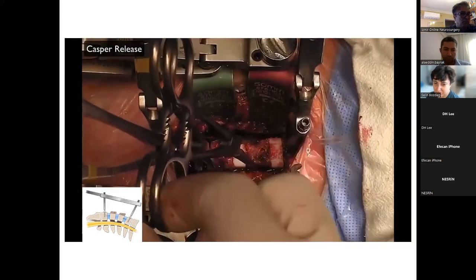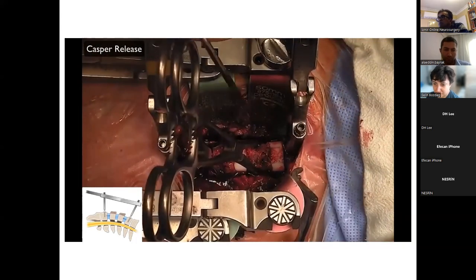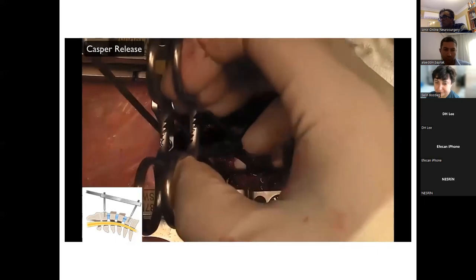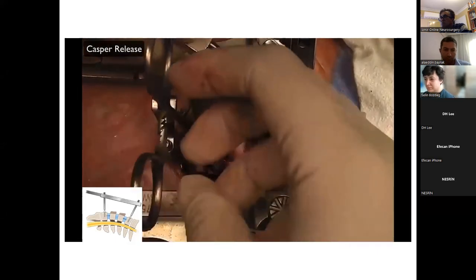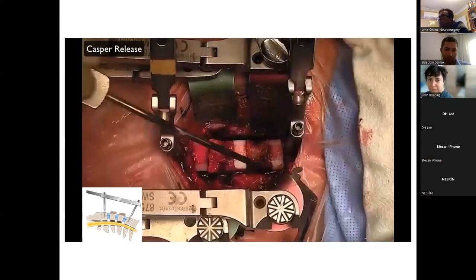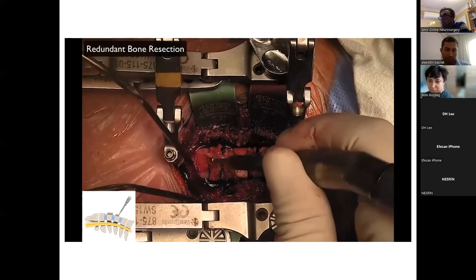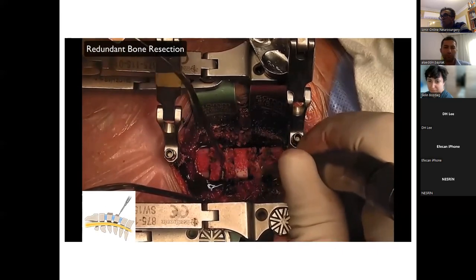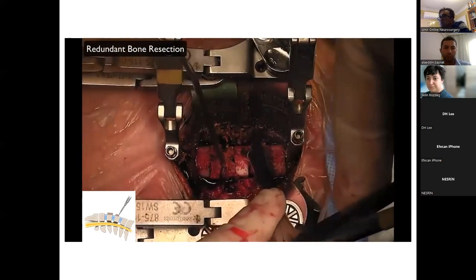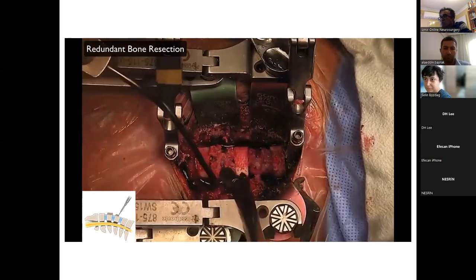First, the allograft is usually inserted at the middle level, followed by the uppermost and lowermost levels. After inserting the bone graft, the Caspar retractors are released to apply slight compression force to the operated segments. This would hold the operated segments in the desired position. Before applying the anterior cervical plate, the anteriorly protruded portion of the vertebral bodies is removed by using a burr and pituitary forceps.